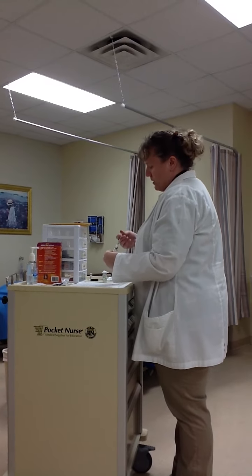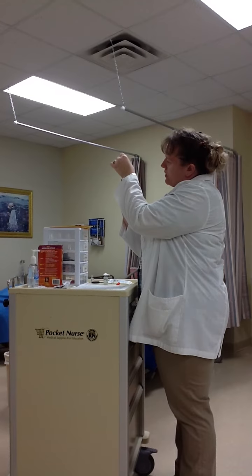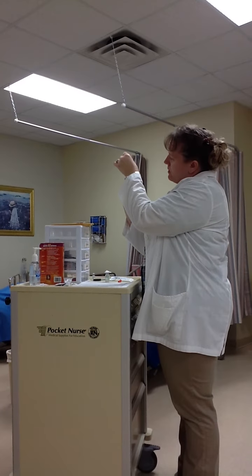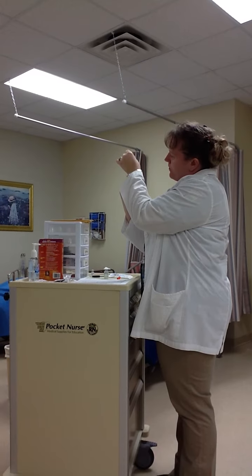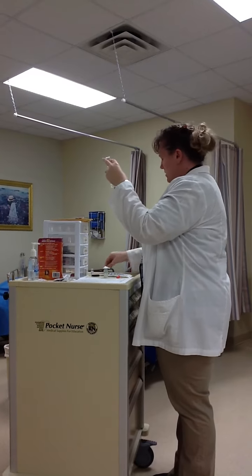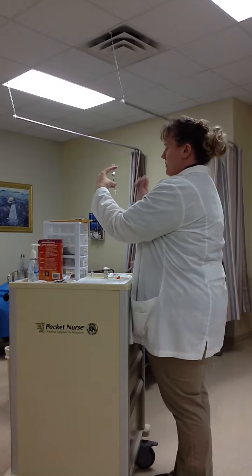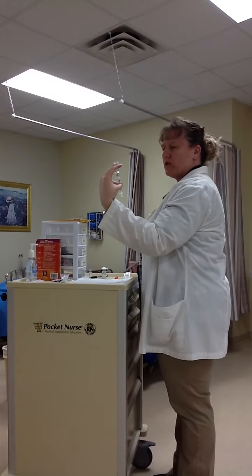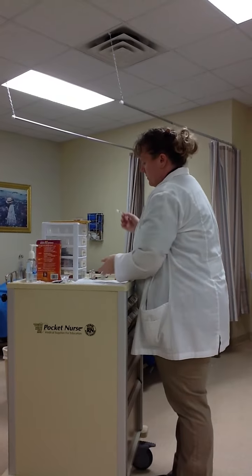And I'm going to put that in, put the air in it, pull it back to 4 units, making sure I do not have any air bubbles. If I note that I have an air bubble in there, I can take a pen and just lightly flick that, and it will get rid of those air bubbles. I now have 4 units. I'm going to show that to my instructor, and I'm going to set that back down and pull it out.